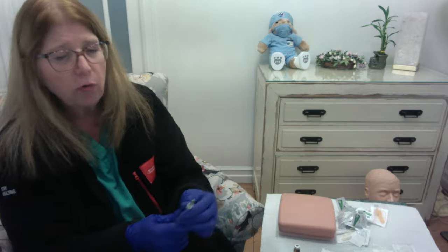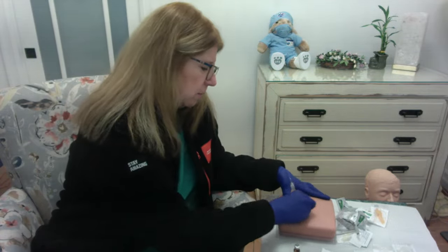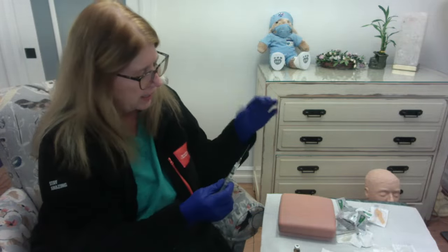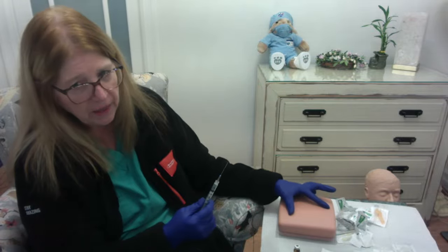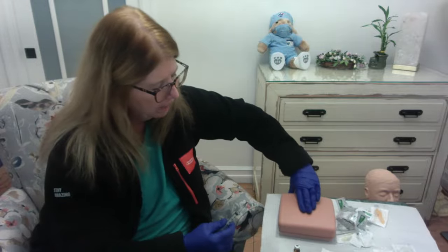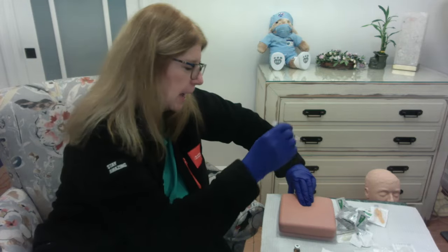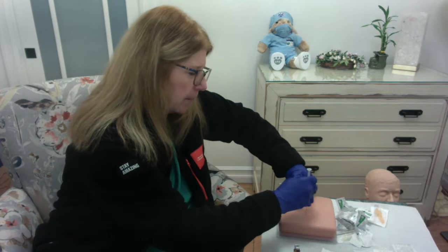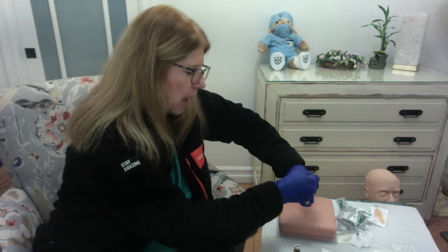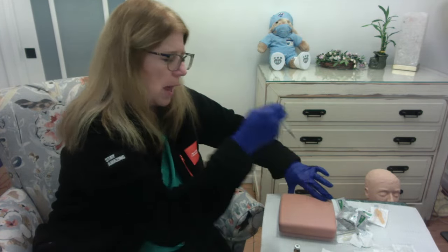So here's what we can do for Z-track. So of course, again, cleaning your skin, okay? Letting it dry. I take my cap off. Instead of spreading the skin like this, I'm actually going to take a couple of fingers and I'm going to pull the skin to the side. And then I'm going to put my needle in. I'm going to do my little aspiration. I'm going to inject the medication. I am going to release the skin and take out the needle.